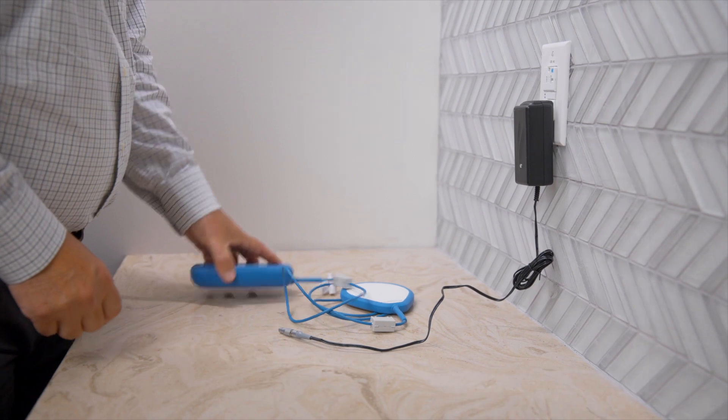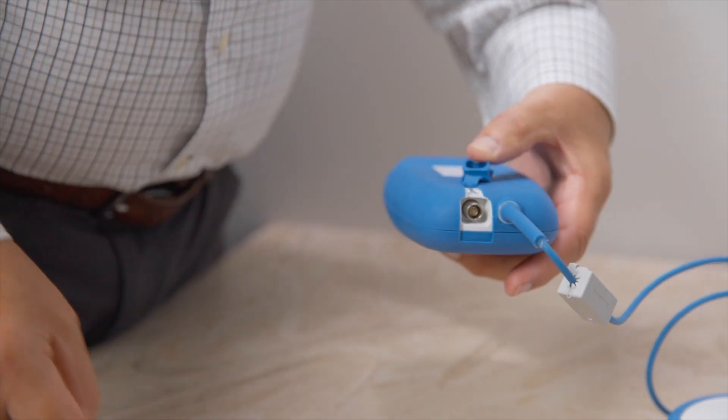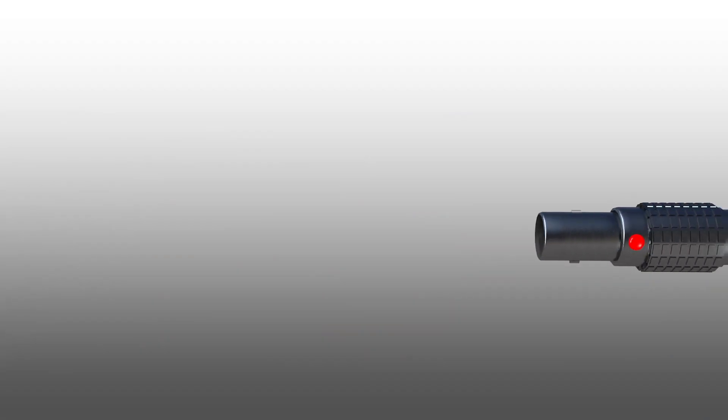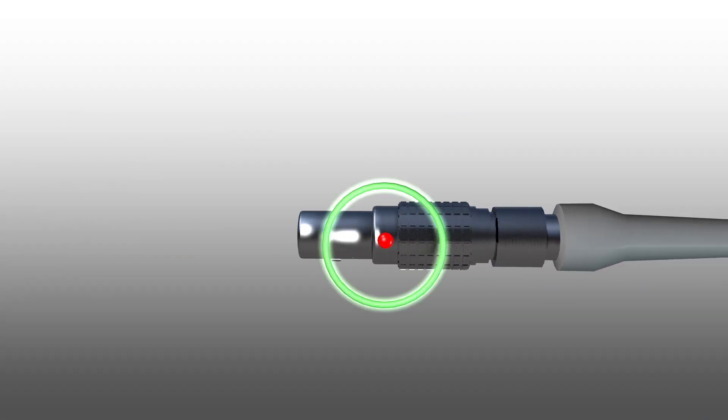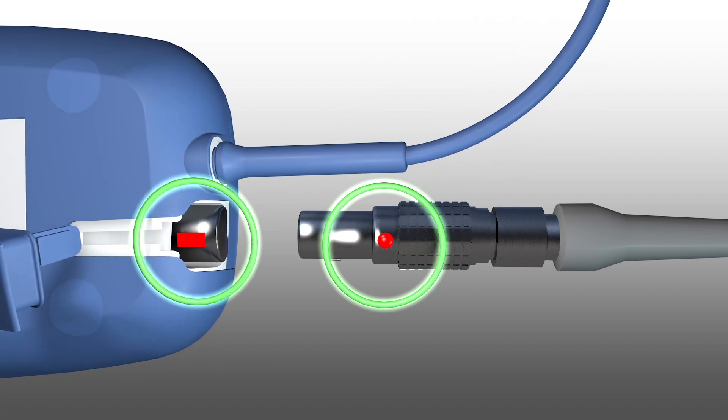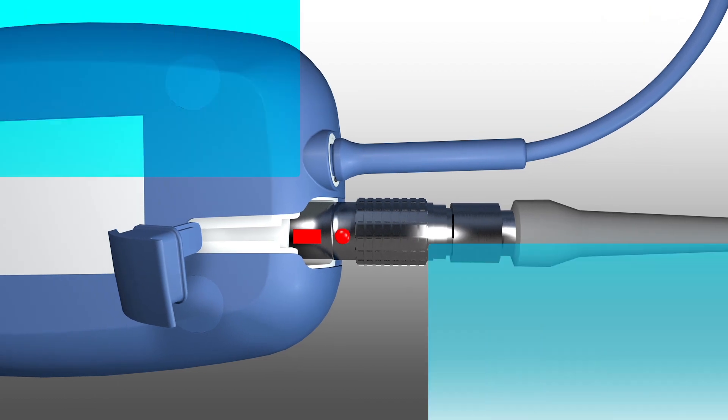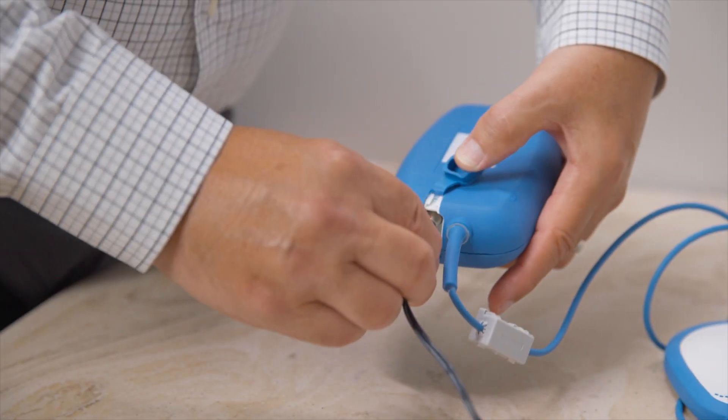Second, expose the charging port by opening the blue cover on top of the charger. Third, locate the red dot on the round silver end of the AC adapter and the red line on the charging port of the charger. Finally, line up the red markings and plug the round silver end of the AC adapter into the charging port.